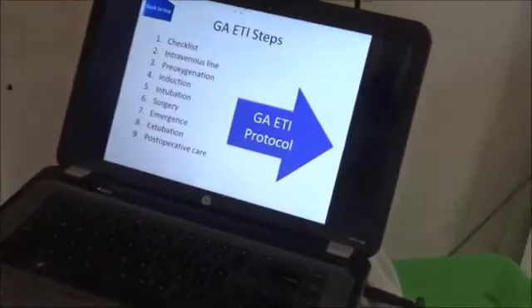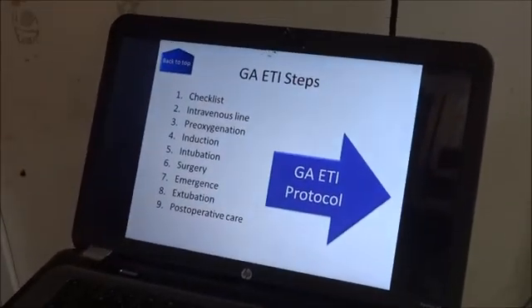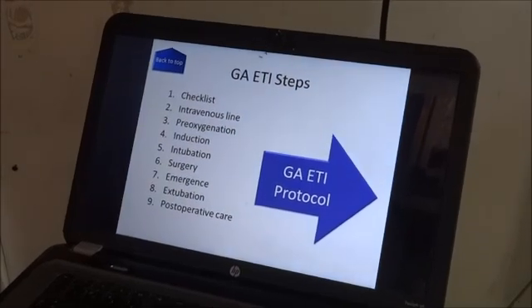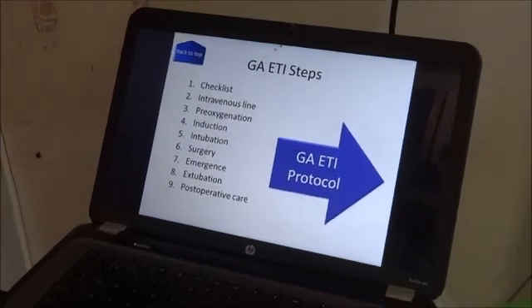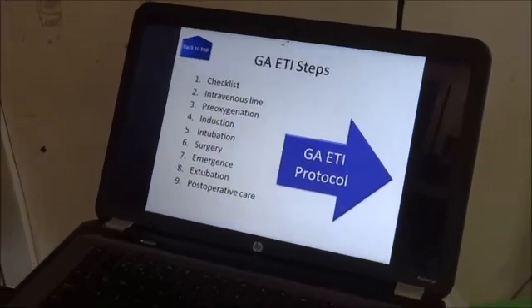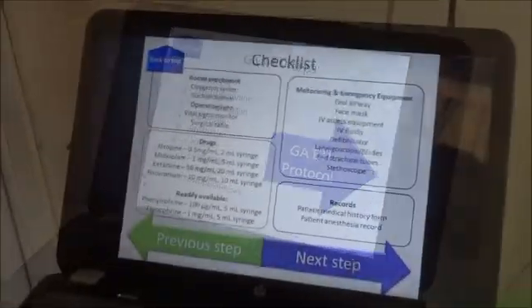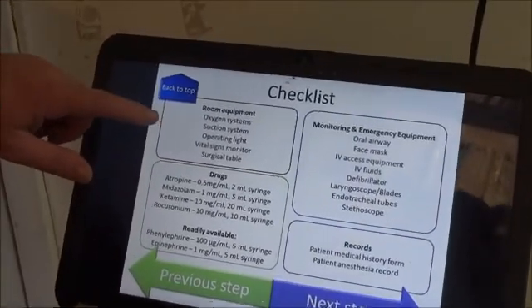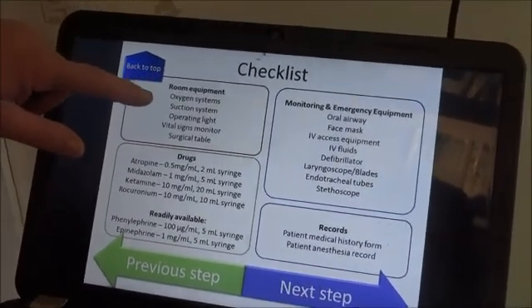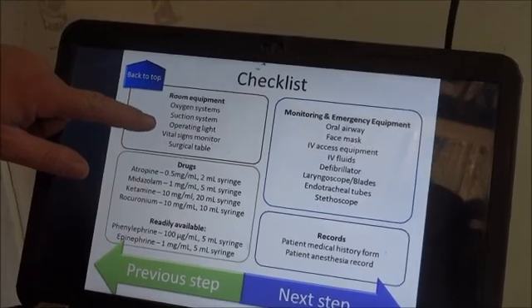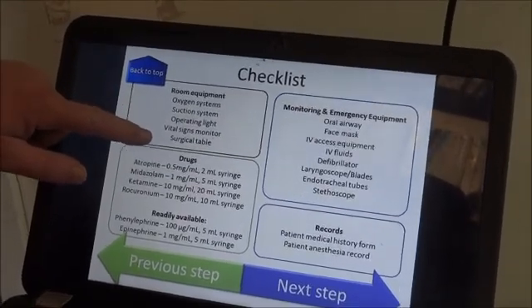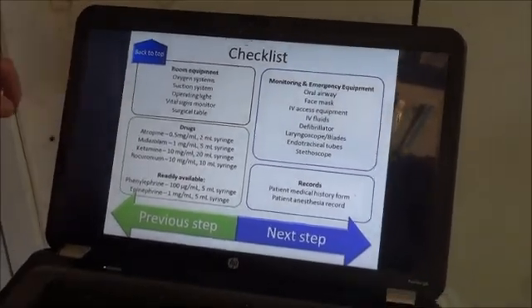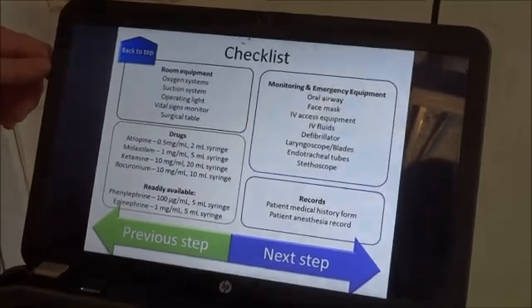Now he's going to have to go through all the different steps of this general anesthesia protocol. The first step is to do the checklist. We need to make sure we have all the different equipment: oxygen system, suction, operating light, vital signs monitor, and surgical table. Obviously, all this is in place.